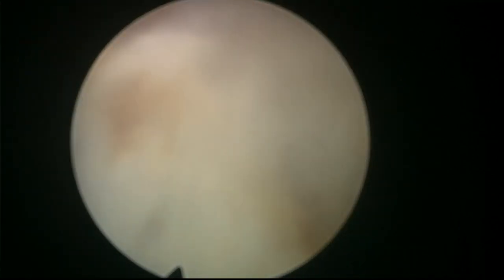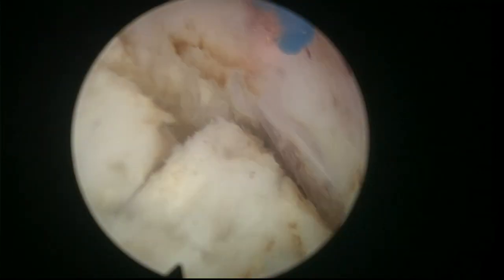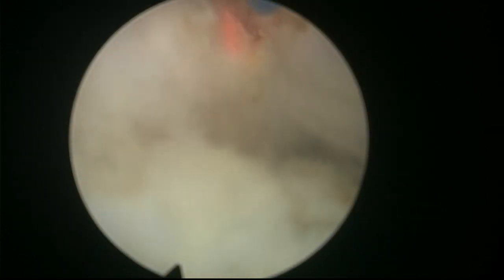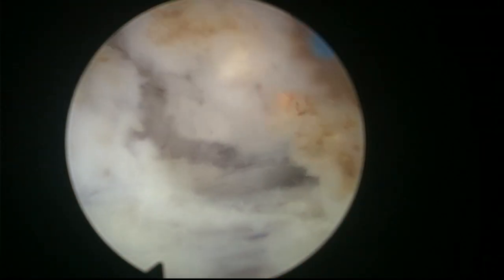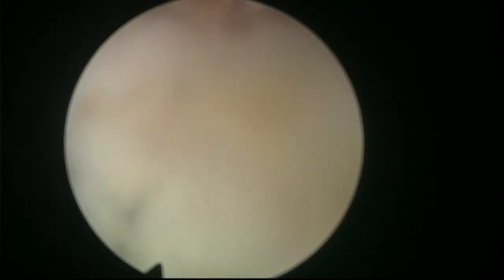Well, I have to say, I don't preserve any amount of tissue anteriorly at the apex, or at least I don't try to. And I have excellent continence. So I think there's a lot of things that we think, or we defend, or we express about HoLEP and what we think about it, that is not really scientific. It's based on expert opinion. And you know that expert opinion is the lowest grade of quality of scientific evidence. So it's probably just an opinion.